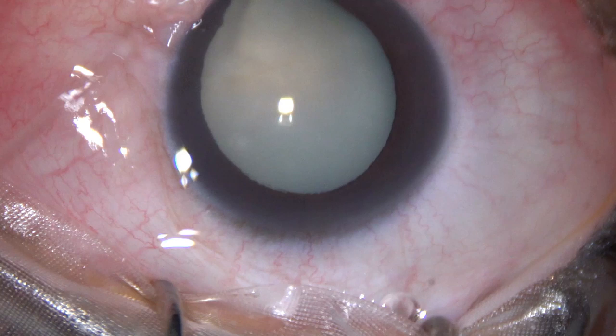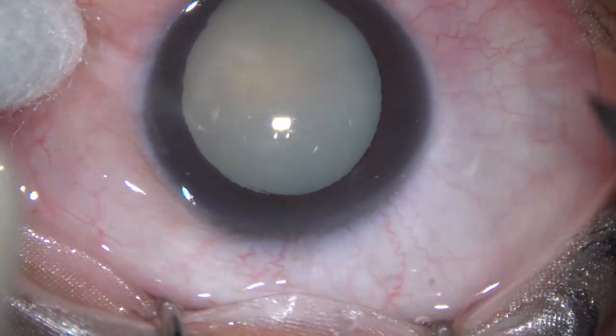Dear colleagues, this is a mature intumescent cataract with coloboma iris. Let us observe this surgery.